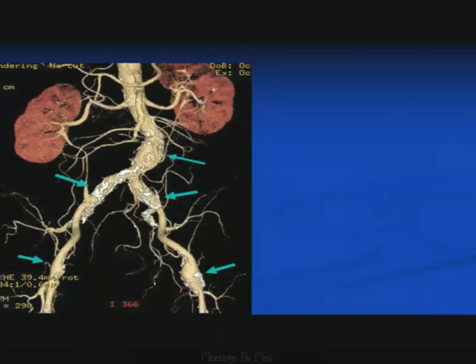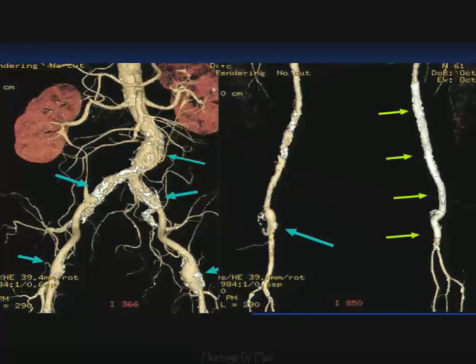So here's another patient who's got aortoiliac disease, but it's aneurysmal. The point here being that there is an aneurysm of the subrenal aorta, but there's also an aneurysm of the common femoral arteries. And I wouldn't be surprised, yes, we have aneurysms of the popliteal arteries in this patient bilaterally. And this patient has had a popliteal artery stent placed on that left side for treatment of aneurysmal disease.